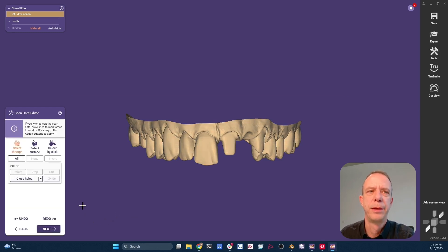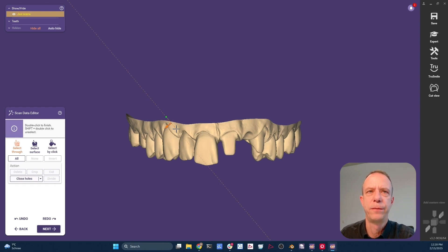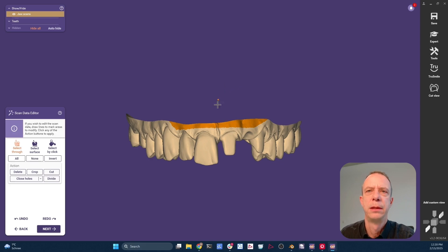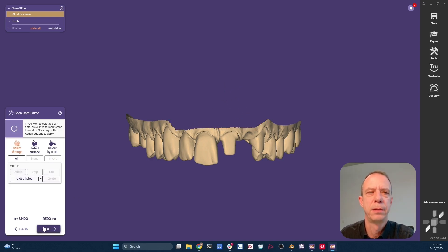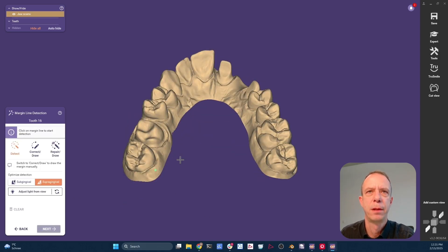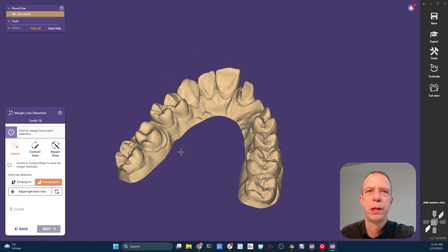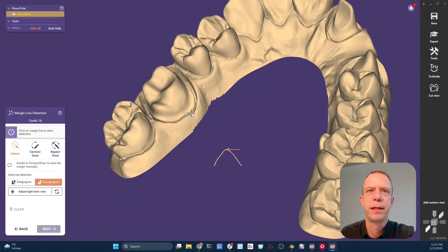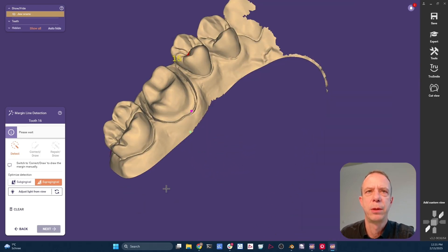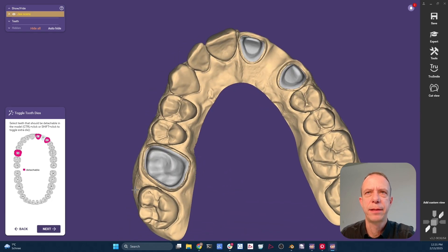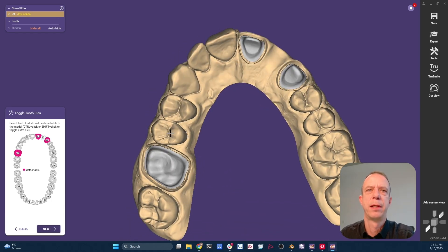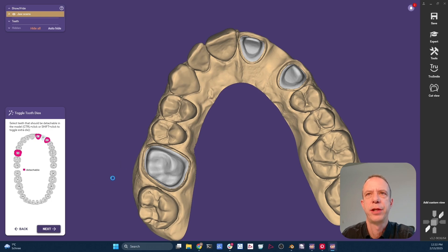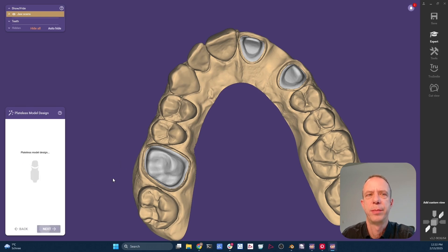And then we can get rid of parts of the scan we don't use. You're going to understand later why I'm doing this here. I'm just removing this and then clicking on next. So now as we don't have any restorations designed yet, I have to tell ExoCAD where the margins are. And again, in the next step, we could design some adjacencies to be removable. I click next and just skip this step.